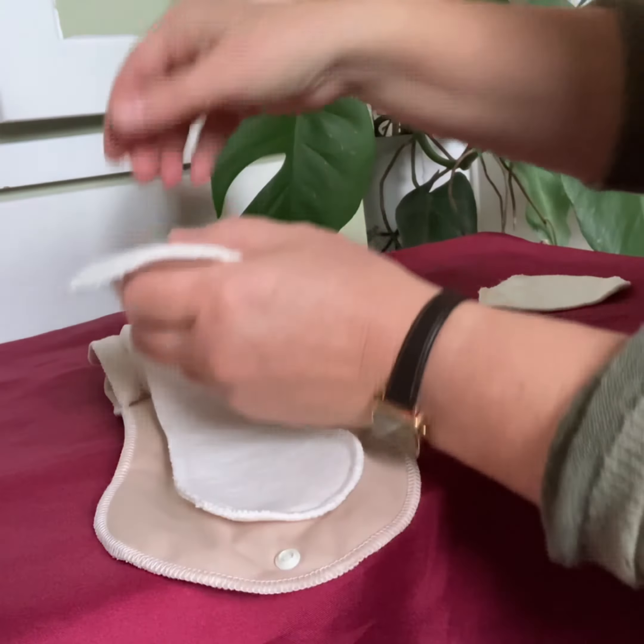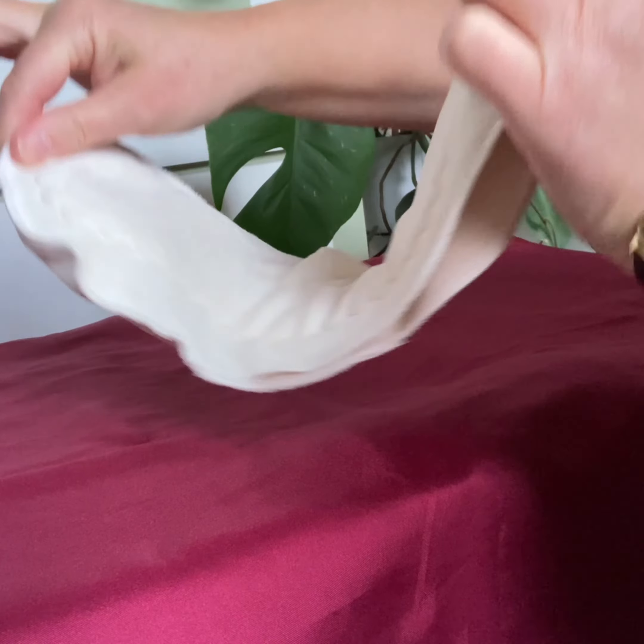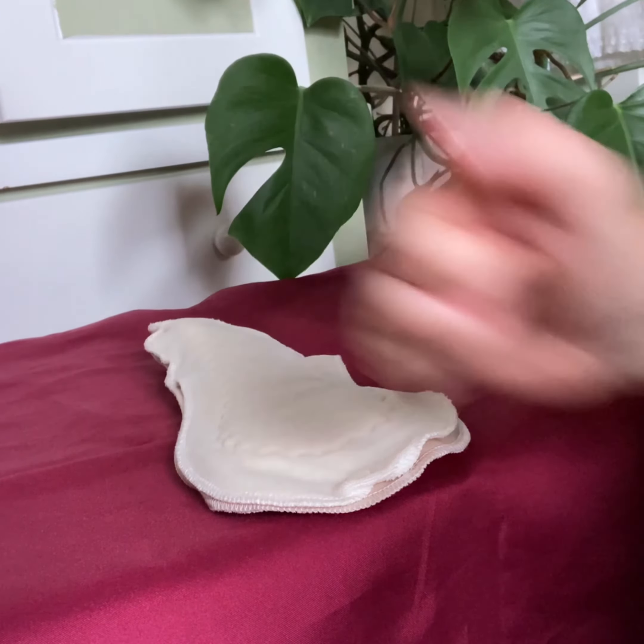That's what the pad looks like once it's ready to use. It's fairly well padded but very absorbent and not too bulky to wear. Overall, this is a great pad.